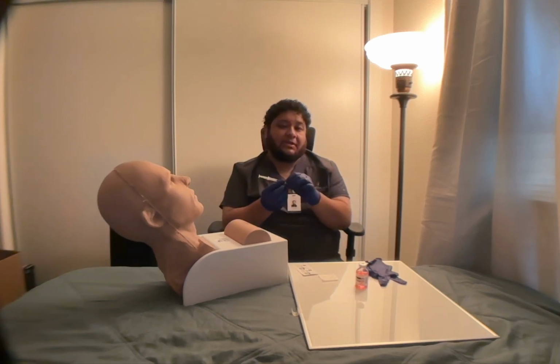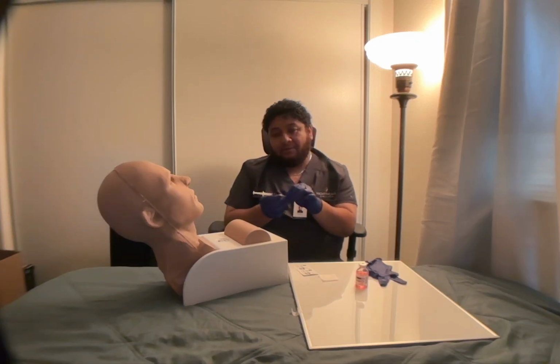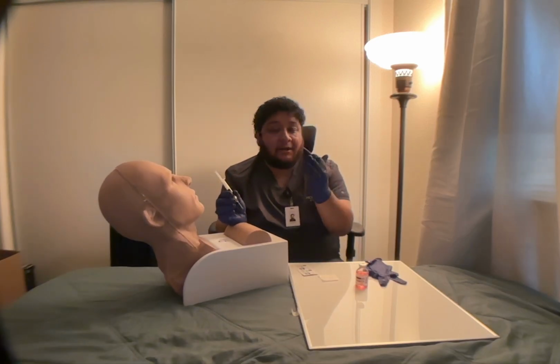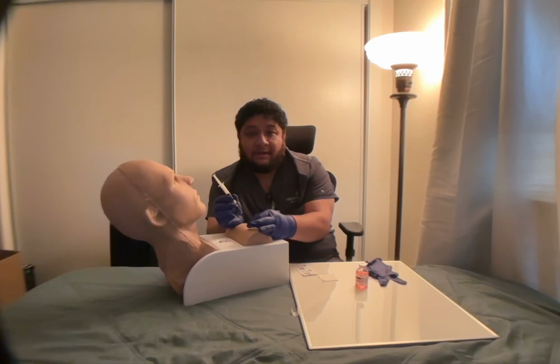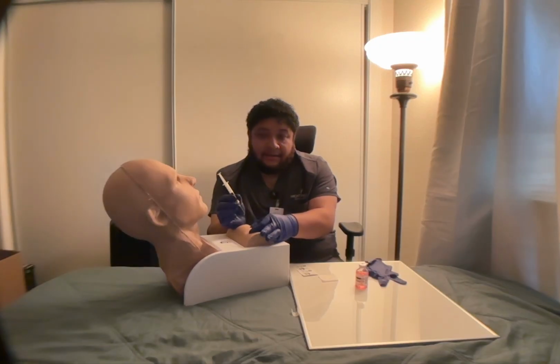I'm going to hold the syringe like a dart with my dominant hand, palm down, and I'm going to use the ulnar side of my non-dominant hand. I'm going to do it so you can see it, and I'm going to spread the skin like so. I don't know if you can see. Can you see? Okay, like that.